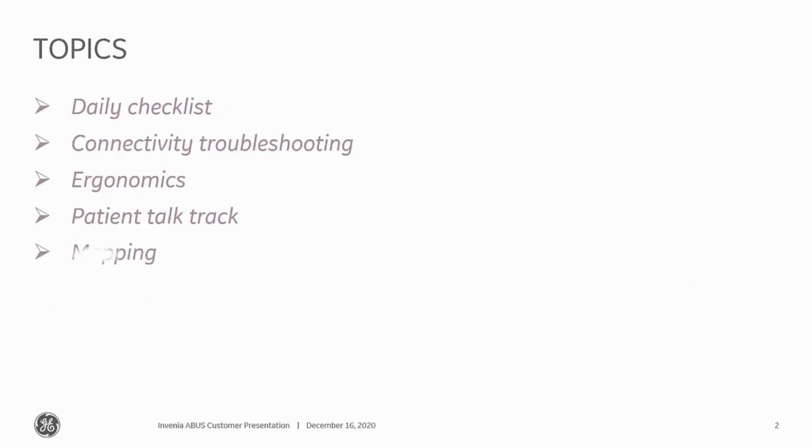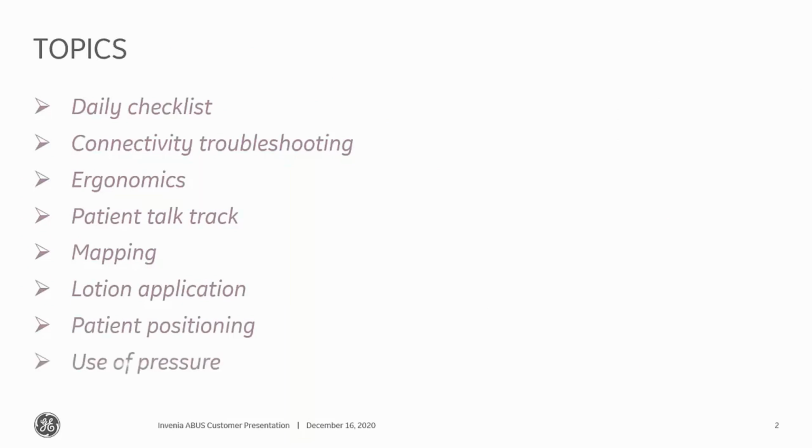Okay, excellent. All right, so these are our topics for today: the daily checklist of connectivity troubleshooting, ergonomics, patient talk, tracks mapping, lotion application, patient positioning, and use of pressure.